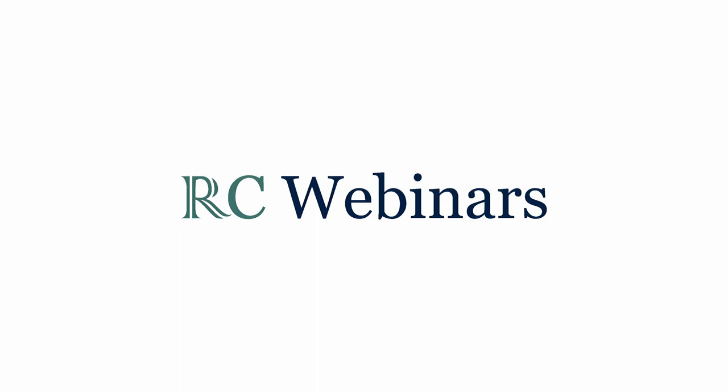Great. And are the CT fusion technologies that you showcased in your presentation available for clinical use now? The one from GE is available, and it's a software upgrade, so you don't need any specific hardware to use it. Other companies also showcase similar technologies, such as the Heart Navigator by Philips, and all of those do not require any hardware upgrades, I believe.